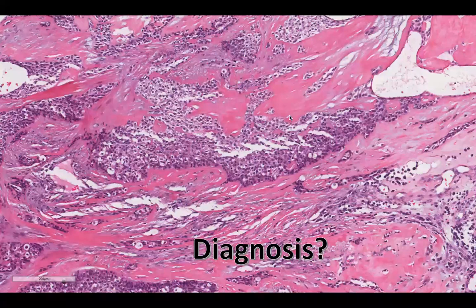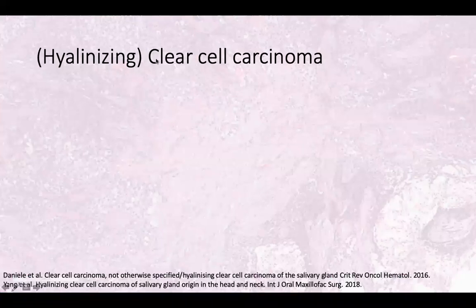Yes. Annie does? All right, what is it? Well, old term, hyalinizing clear cell, new term, just clear cell. Okay, awesome, well done. All right, you're not going to get fired. Yay! So well done. And she got it with the terminology right.